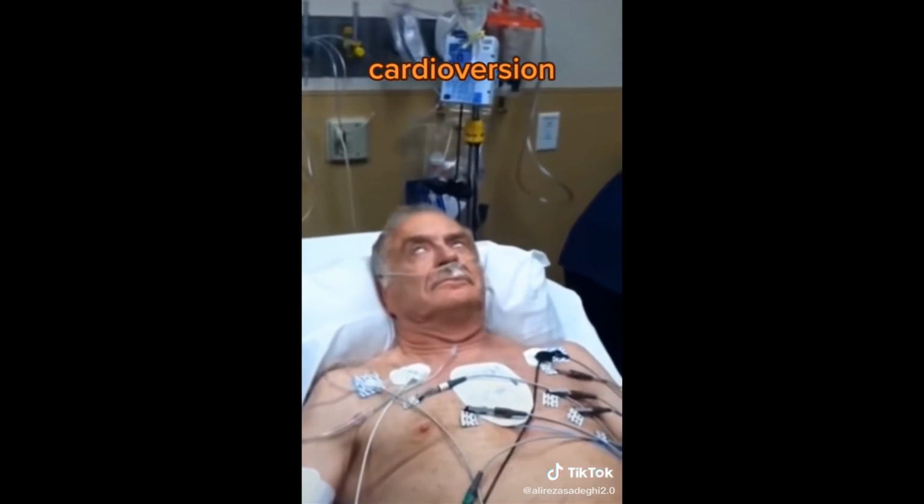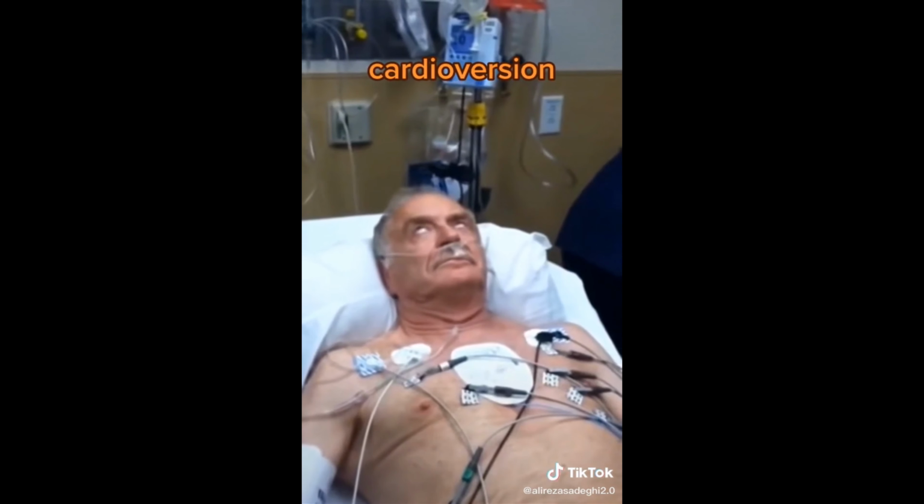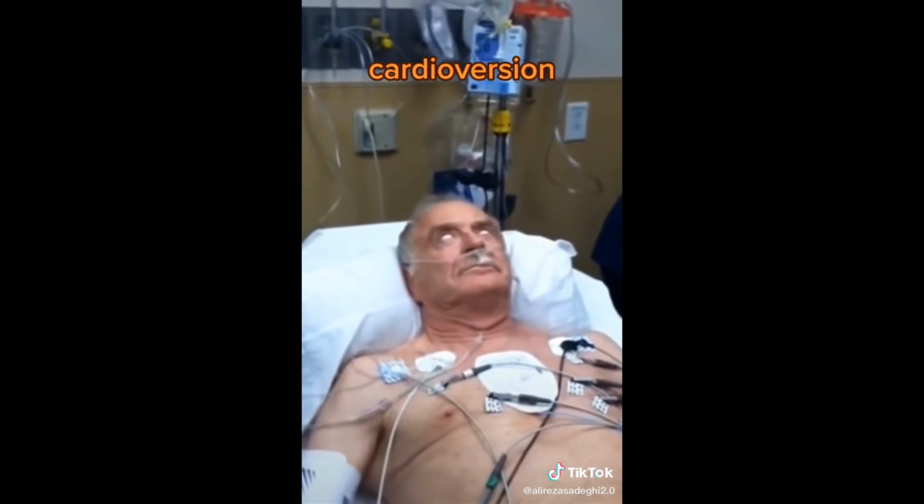Example of cardioversion. Okay, here, let's go ahead and get going. Okay, we're about to start here. I wouldn't touch him, actually. So you got sedation, everyone clear? Consented.